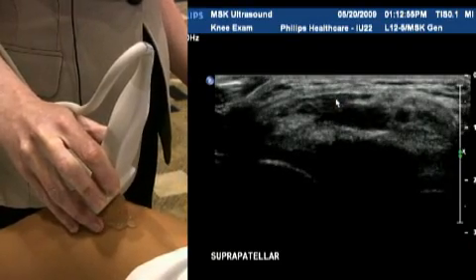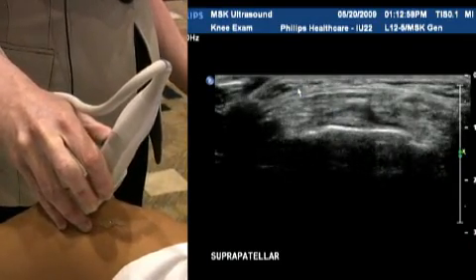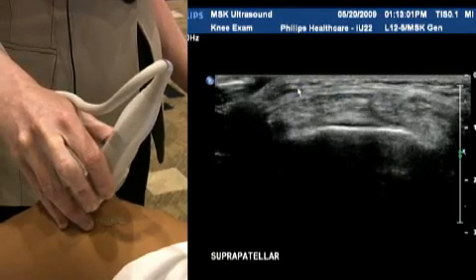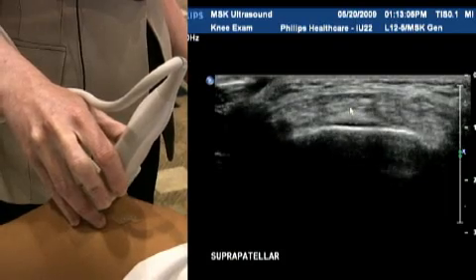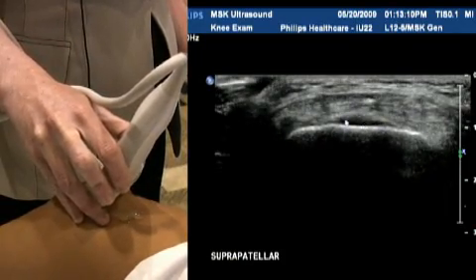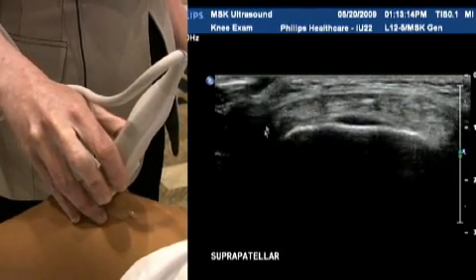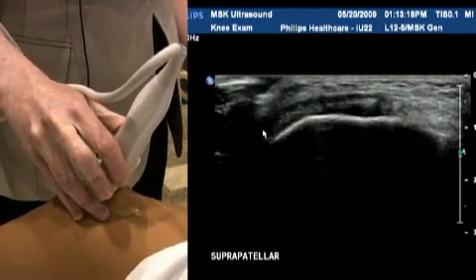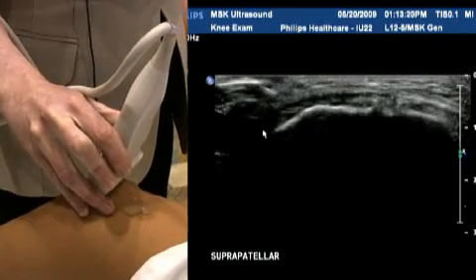So you don't want to create a false positive there. Just make sure that you keep 100% perpendicular to the tendon. You can see that the fibers fill in and it becomes nice and echogenic — that's exactly what you're looking for. Underneath you'll see a small amount of cartilage, which is quite normal; try not to mistake this for fluid. Just track it all the way down onto the superior portion of the patella.